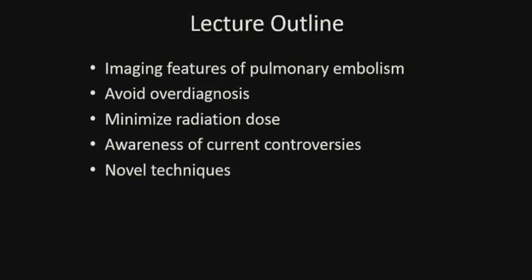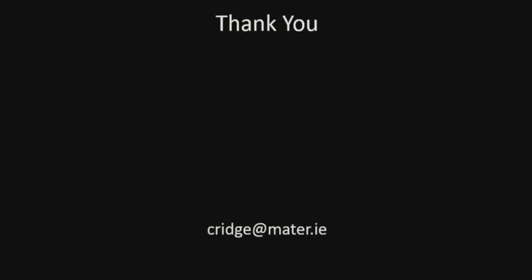In summary, it's crucial to correctly identify pulmonary embolism, avoid overdiagnosis due to mimics, minimize radiation dose, and have an awareness of the current controversies and novel techniques that may help address the challenges of pulmonary embolism imaging. Thank you very much.